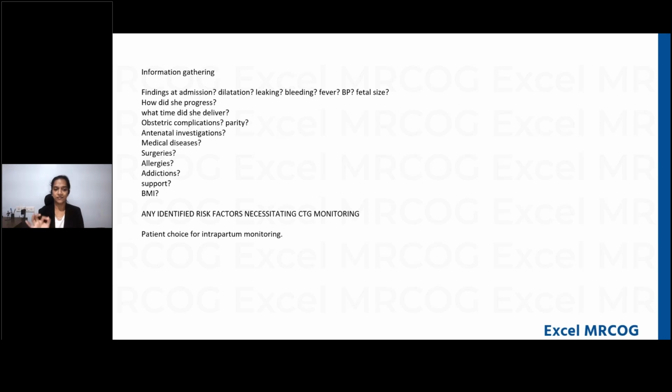So any identified risk factor that is necessitating the CTG monitoring, you would need to identify in this station because there is a patient involved. It is not just a simple CTG teaching station. There is patient management as the task. So you need to know details of the patient, right? You need to ask this background information.